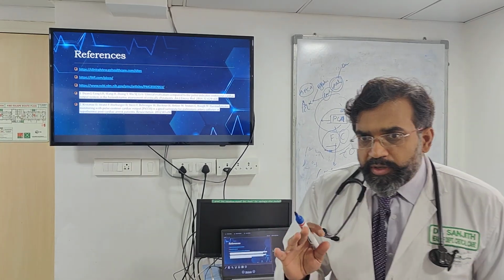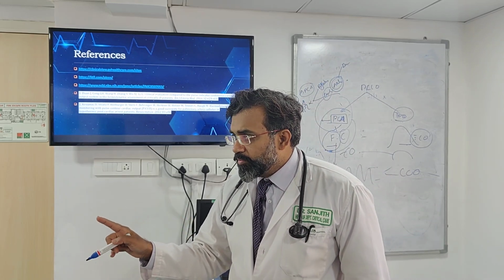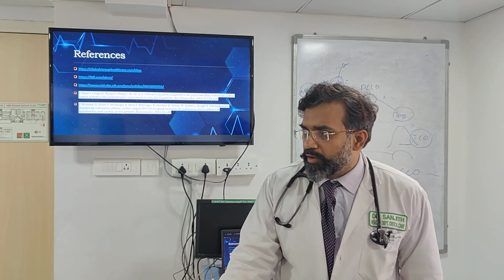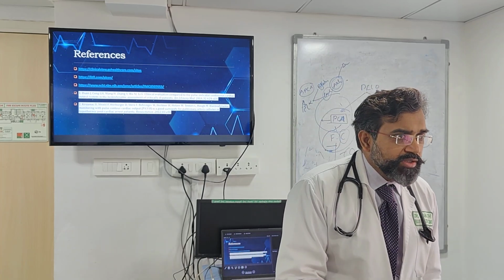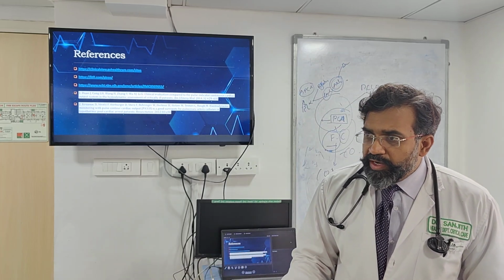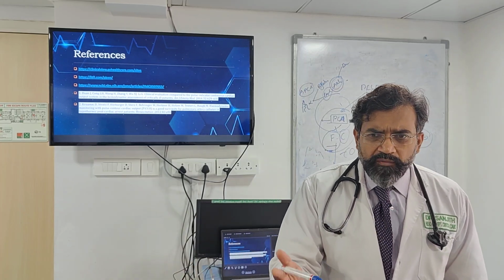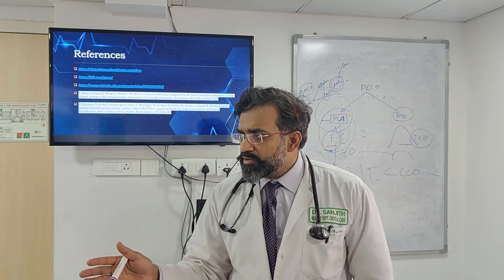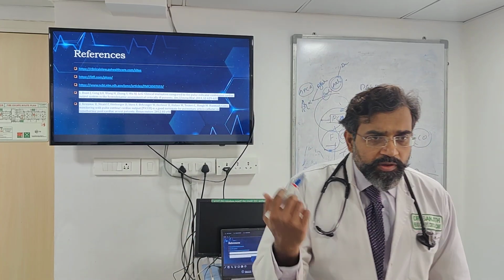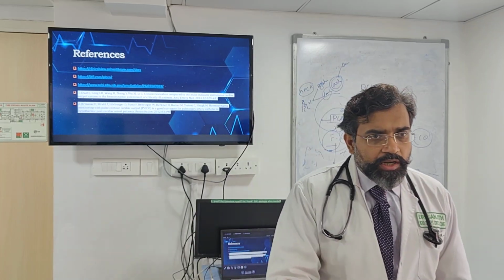So now I've given you 3 times when you need to do thermodilution. What she said is at minimum. So if you've really not done anything, better do it in 8 hours. The second is when we have actually altered the vasopressors or given a fluid challenge, or in short, we have altered the compliance of the vessels. If you have reduced or increased your vasopressors, or if you have given fluid and after that you've seen some changes occurring, you actually need to do a thermodilution.